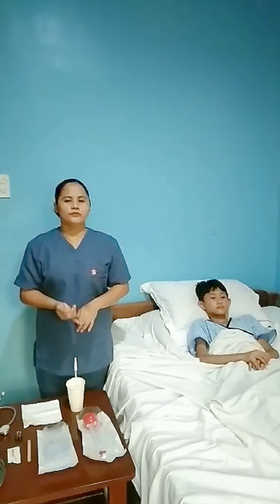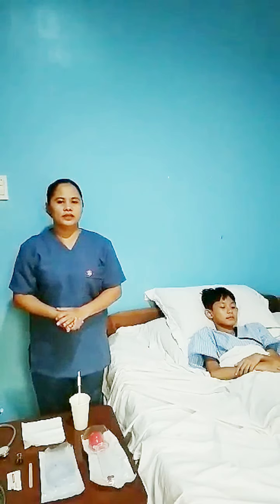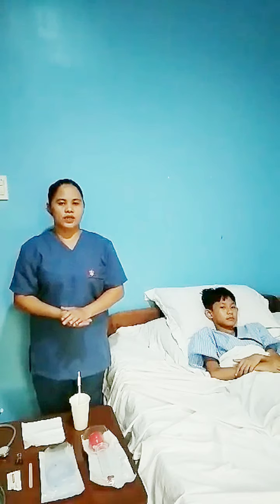First is to administer tube feeding and medication for patients who are unable to swallow by mouth or eat sufficient diet without aspirating food and fluid in the lungs. Second is to establish a means of suctioning stomach contents to prevent distension, nausea, and vomiting. Third is to remove stomach contents for laboratory analysis. And fourth is to lavage or wash your stomach in case of poisoning or overdosage.